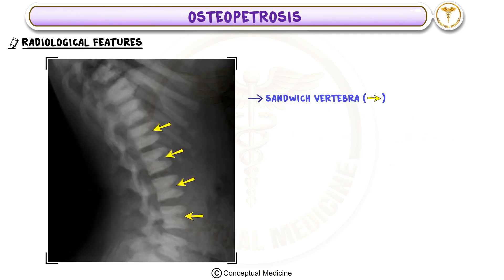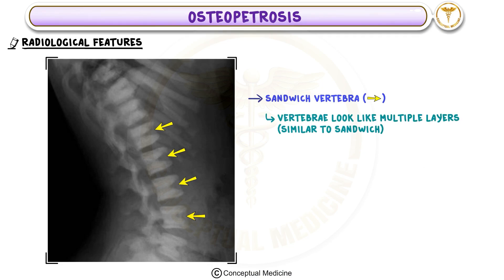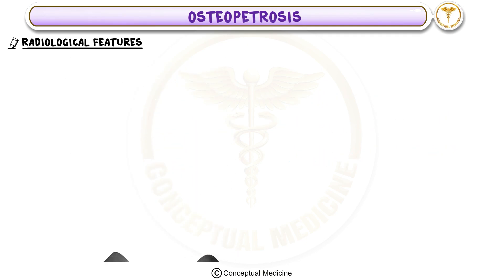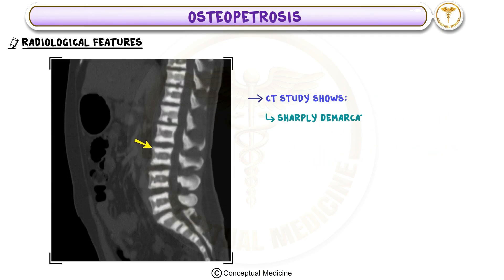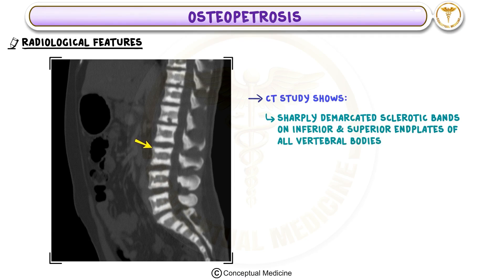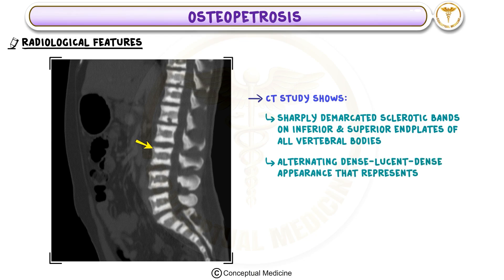Radiological Feature 2: Sandwiched Vertebra. The vertebrae look like they have multiple layers, similar to a sandwich. This is a key radiological feature of osteopetrosis and helps to confirm the diagnosis. The CT study shows sharply demarcated sclerotic bands on the inferior and superior end plates of all vertebral bodies, with an alternating dense-lucent-dense appearance that represents accumulations of excess osteoid.